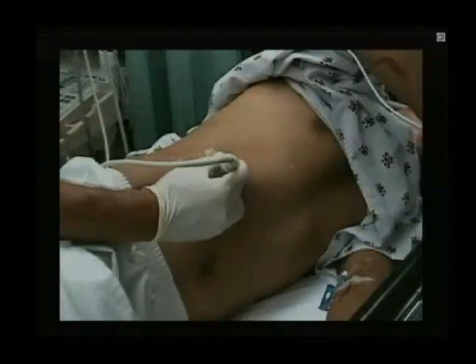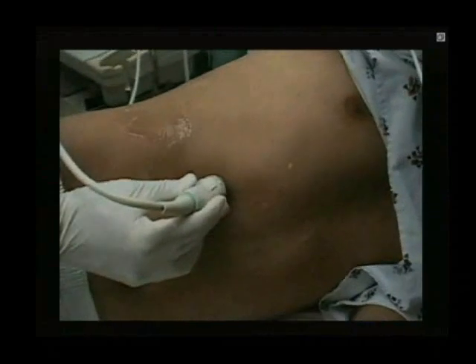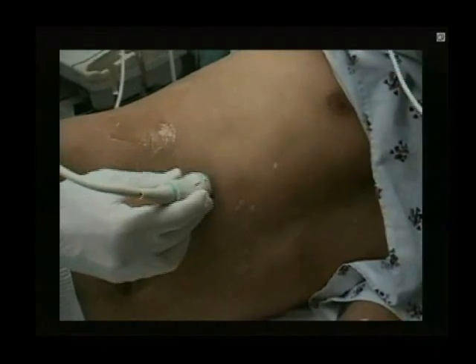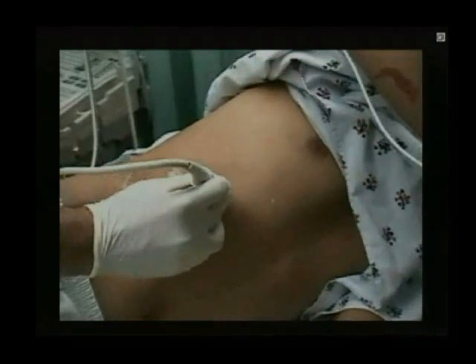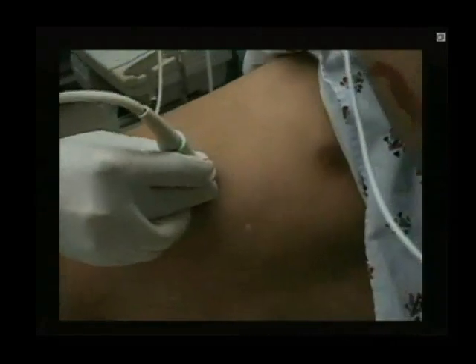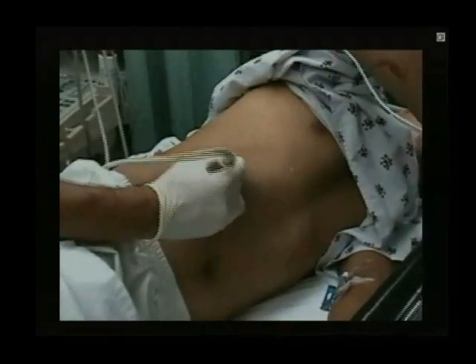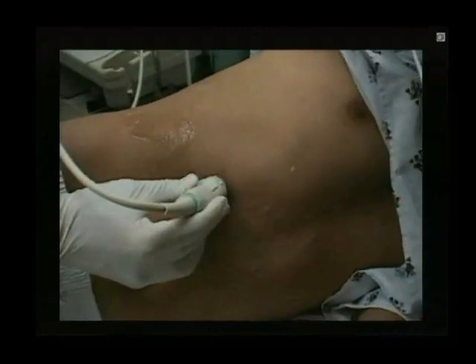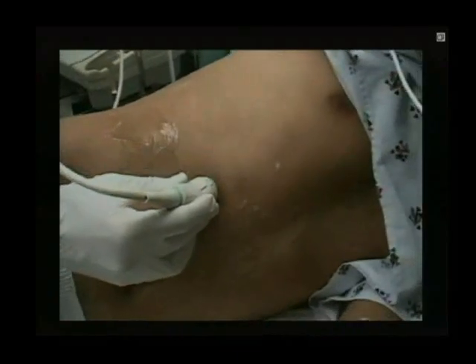So here's someone that we're scanning right now, and we've got him turned to the left lateral decubitus. And I want to point out how we're scanning him. First thing is the marker that you're going to see, and the marker is right up here at the top. This is the marker right there. There's a little dot right there. That's pointing right now to the right shoulder. Basically, if you draw a line along the costal margin, which will go this way, this is a dot right here. That's the dot.